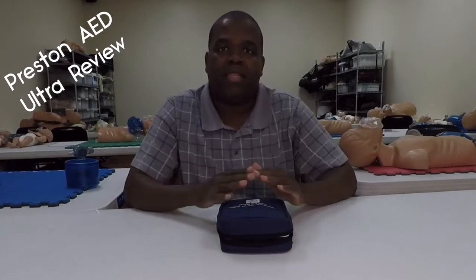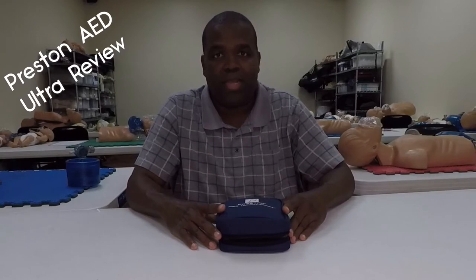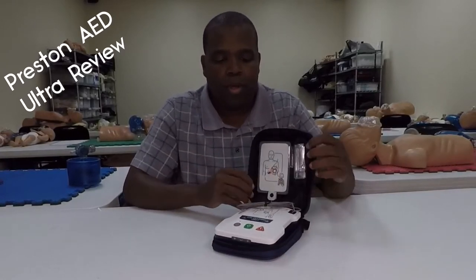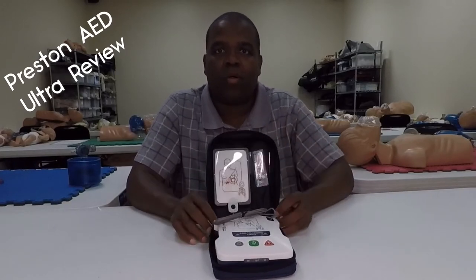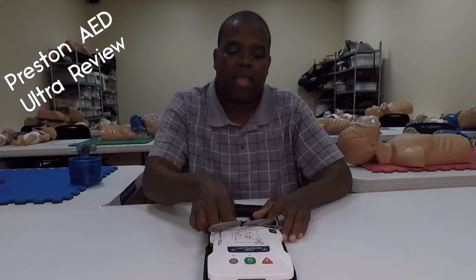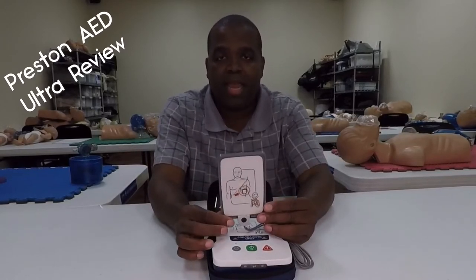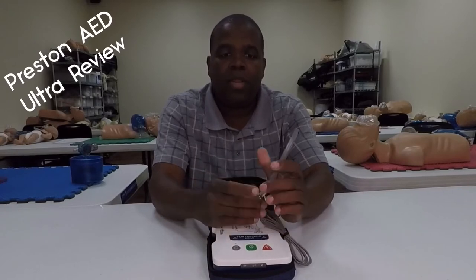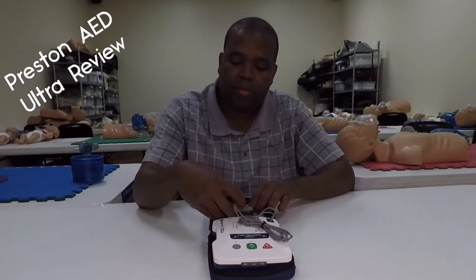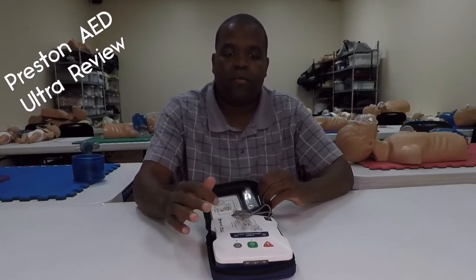First thing, I like the little case — it's small, it's simple. If I want to take a couple of these, I can just load them up. They're lightweight. When you pop the case open, everything is already in there; it's its own little carrying case. The pads, just like the other Prestan AED Trainer, are on the actual card, so we can just stick them right on there. It's got a neat little spot for them to be stored, and there's plenty of cable on there.